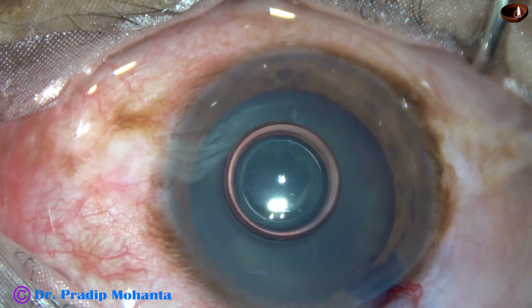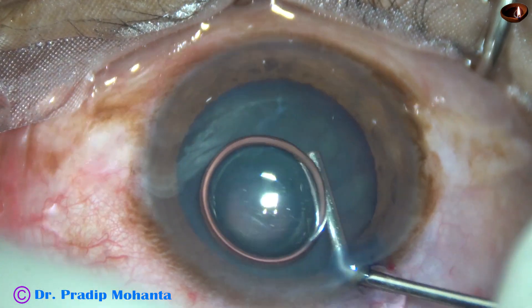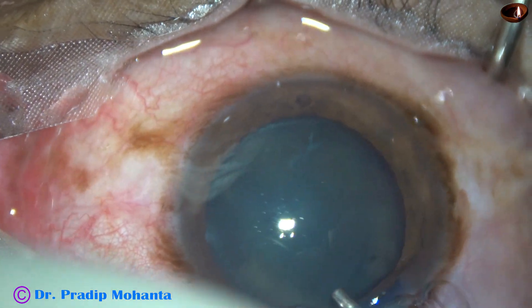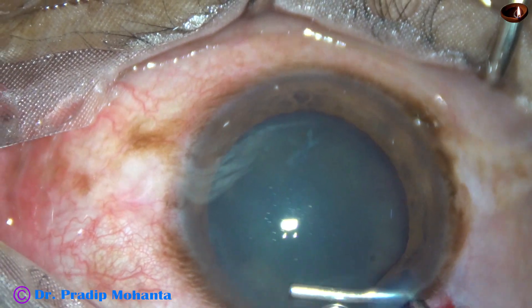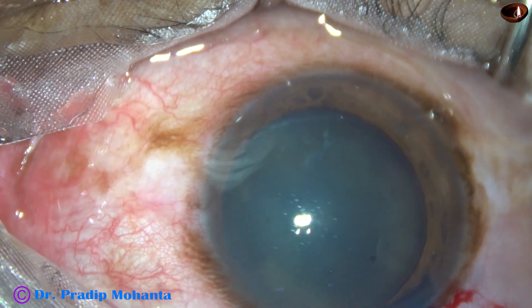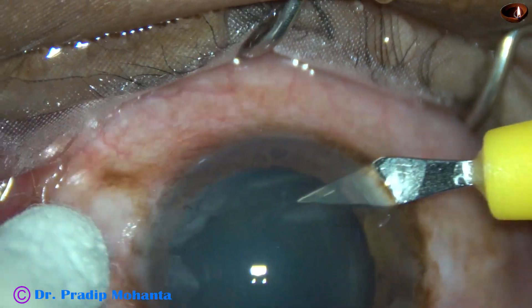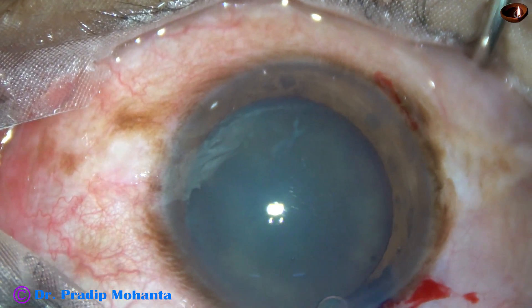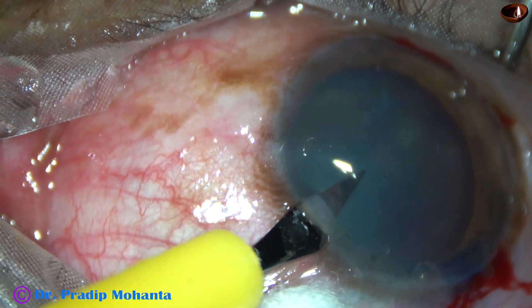2% hydroxypropyl methyl cellulose is injected to fill the anterior chamber. Now I am going to make 2 side ports — one on the right side and one on the left side.